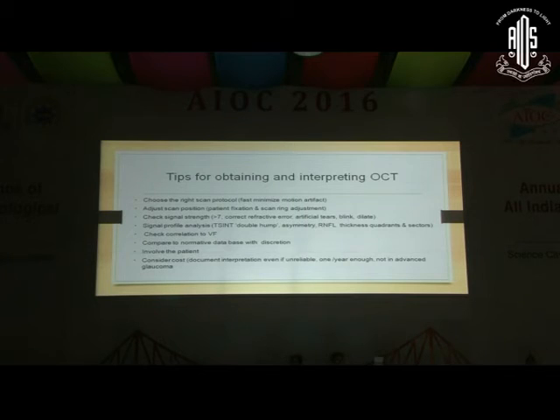Involve the patient. Show them your scans. Let's say you have a patient who's very worried, has a bad visual field. Show them that your scan is normal, you don't need to worry, and just keep them on follow-up. On the other hand, if you have a patient who's very erratic with their medication and you show them that their scan is really poor, they might actually get convinced to be more compliant with their treatment.